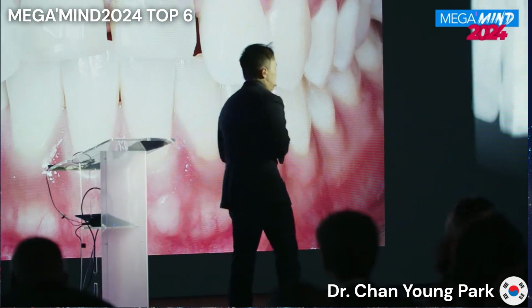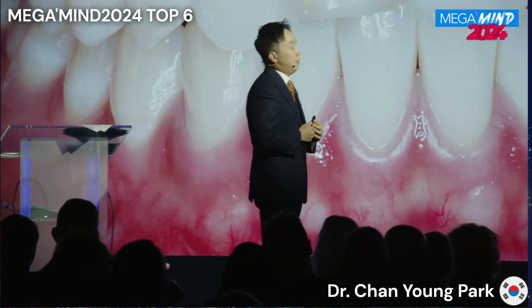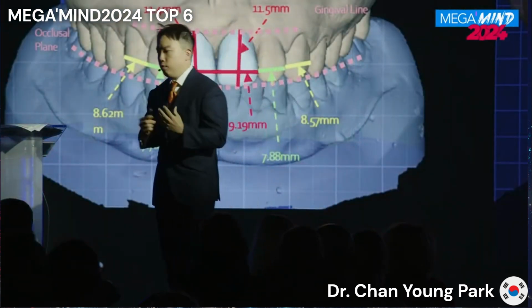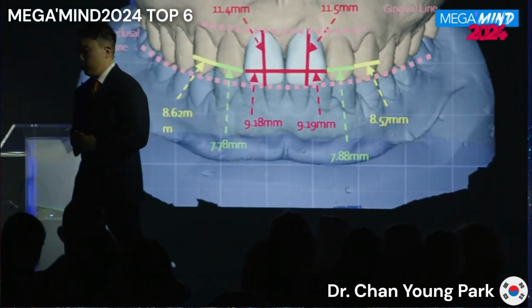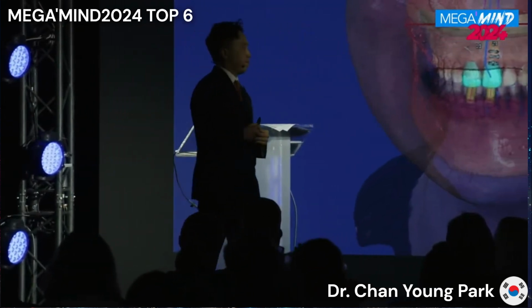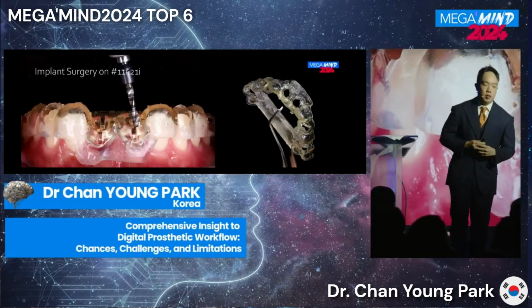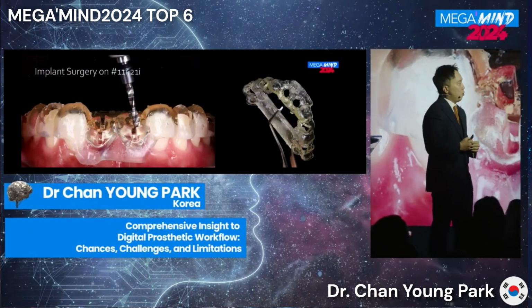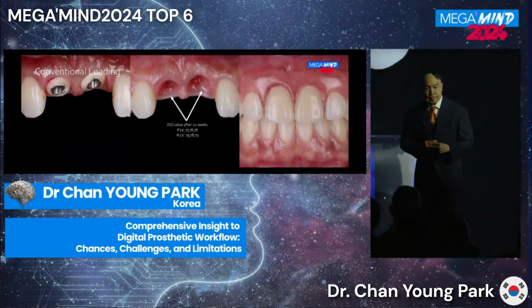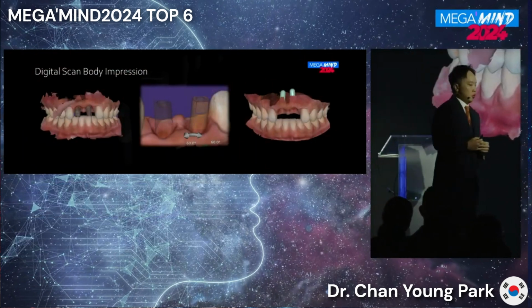And by the looks of the initial examination, the 2 teeth seemed hopeless to be saved and needed some implantation. So careful planning was done regarding the facial aesthetics, to design the surgical guides for implant surgery. And the surgery was done, but the initial stability was not reported to be enough, so we had to wait for several weeks for the conventional loading. And after waiting for some weeks, a digital scan body impression was taken.